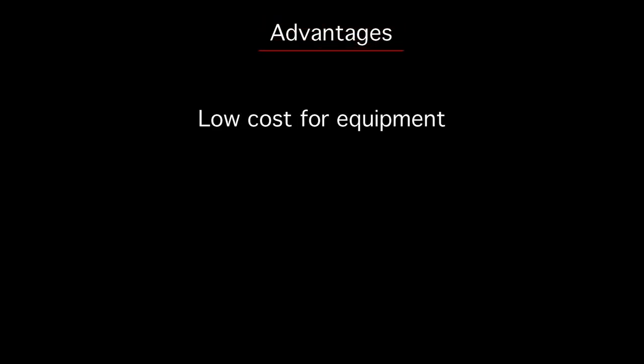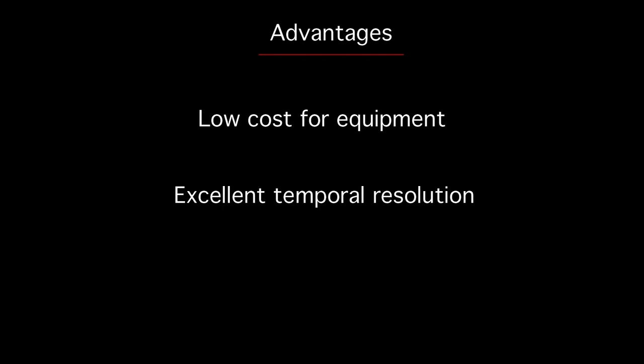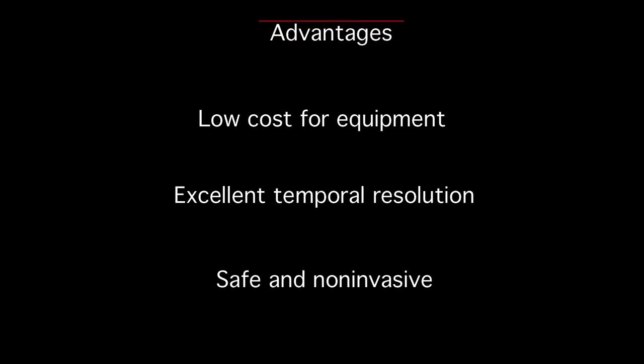Nevertheless, there are many advantages to using EEG techniques in neuroscience experiments, including its low cost for equipment and materials, its temporal precision on the order of milliseconds, and the fact that it is safe and non-invasive for use on participants of all ages and most clinical groups.